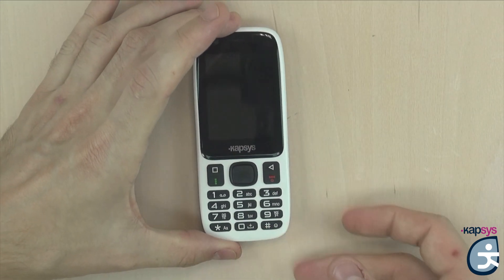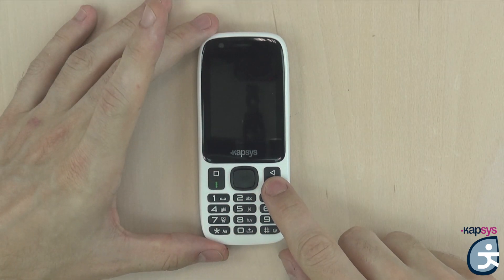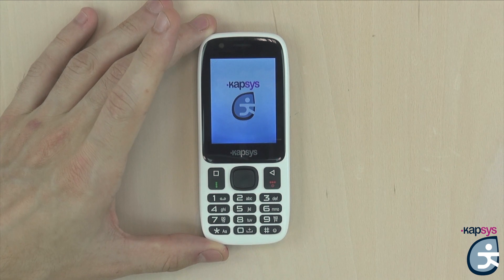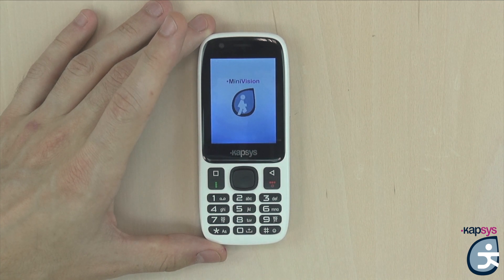That's it for the description of the Minivision. We will now start the product by doing a long press on the hang-up key located at the bottom right of the joystick. When the phone starts for the first time, you will have a little vibration, then a Capsys loading screen with a little music. The first time you start the phone, you will have a quick setup phase where you choose the language and whether to activate vocalization of the screens.